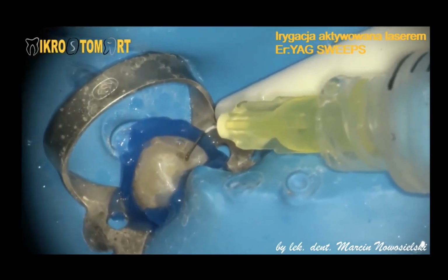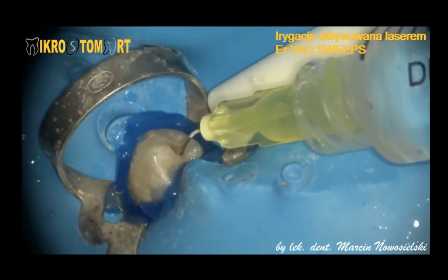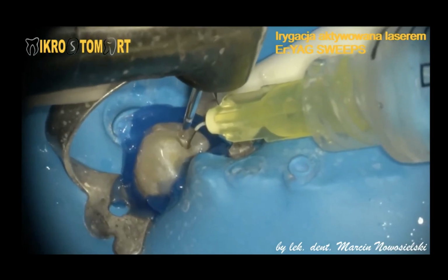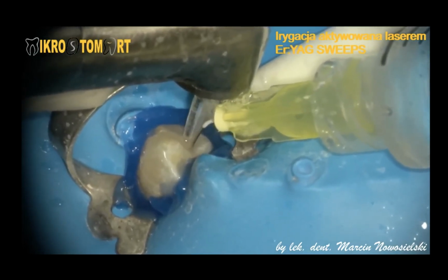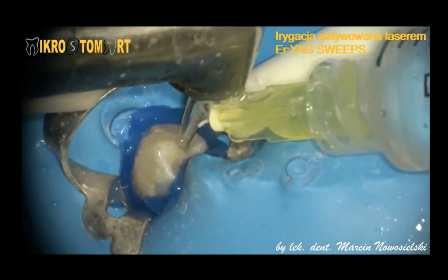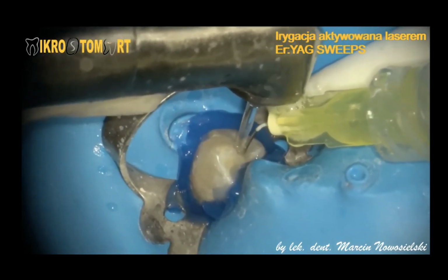It goes in every isthmus. It flushes every lateral canal very well. It goes to the delta. It goes to the apical area perfectly, because it destroys the vapor lock.